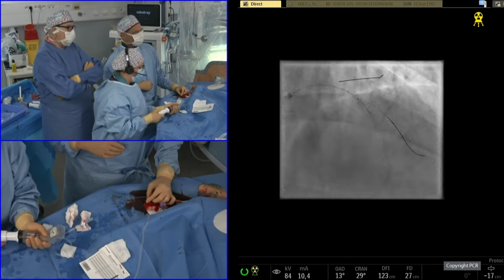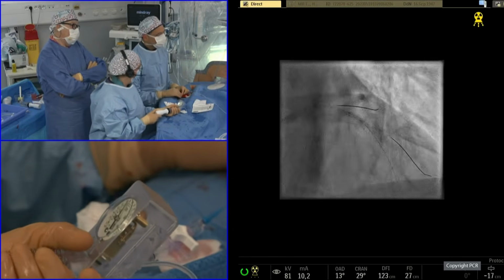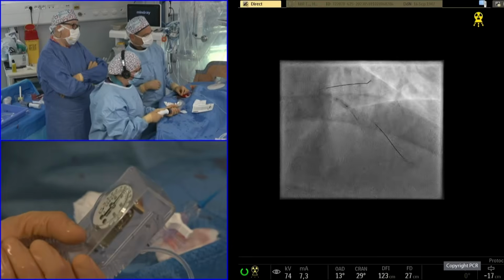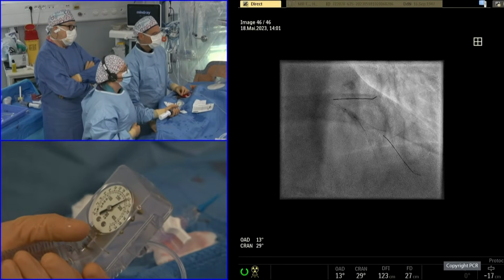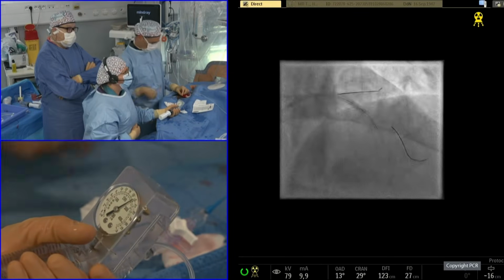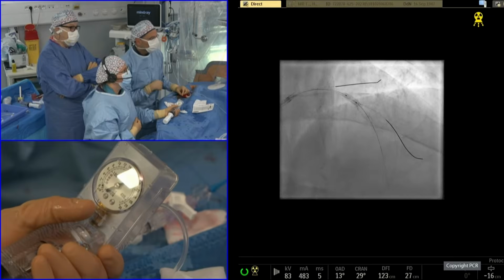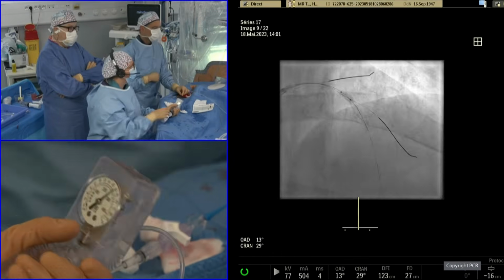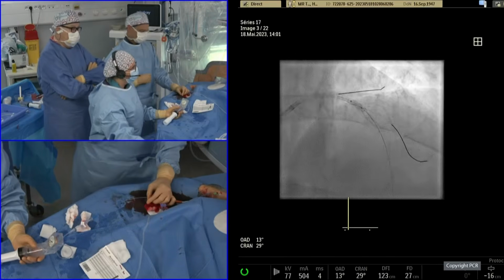Yeah, the wires are diverged, just to help our colleagues. By implanting the stent, you actually push laterally a wire that is jailed in the diagonal. So the recrossing point of the wires is always more proximal than the real actual carina. And that's why you are explaining to Thierry to go a few millimeters distally and be with the distal marker just in front of the carina. Any comments by the experts?